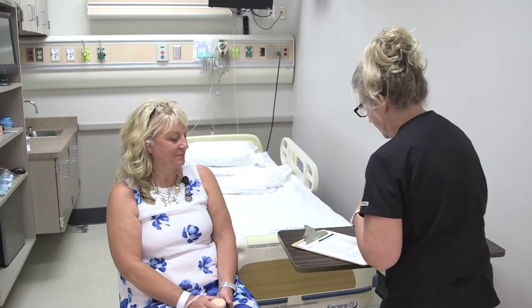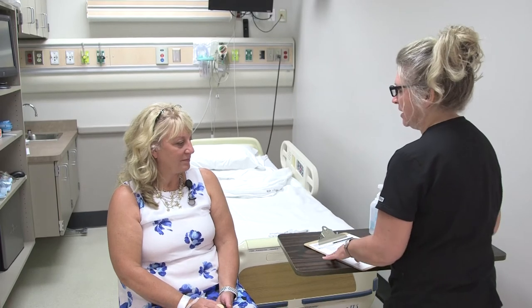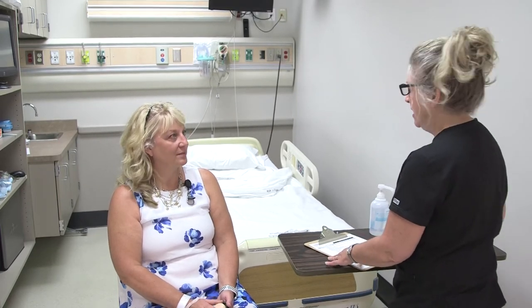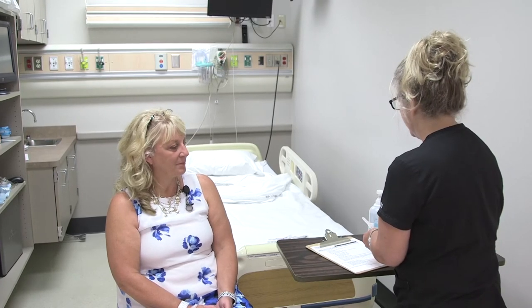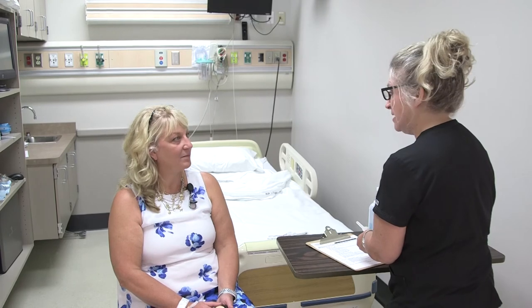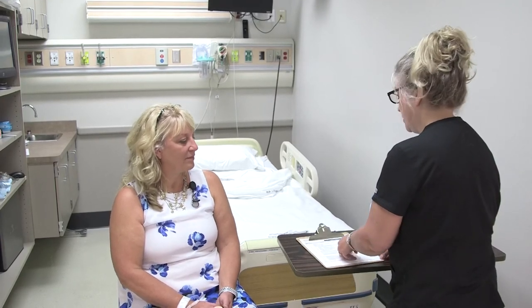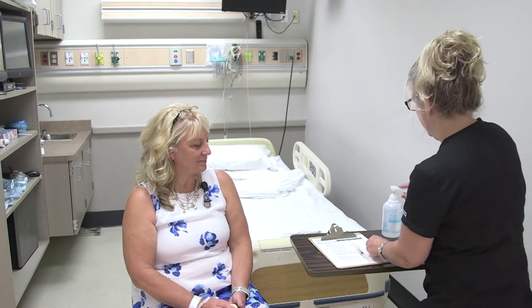No. Okay, very good. All right, so I have your medication ready here, but I'm just going to do one more check on the computer, and we'll do our last medication check to make sure I have the right medication and scan it, so you can talk over that. And when I'm done doing that, then I'm ready to go ahead. Okay. All right, so I'm going to give you your medication now.